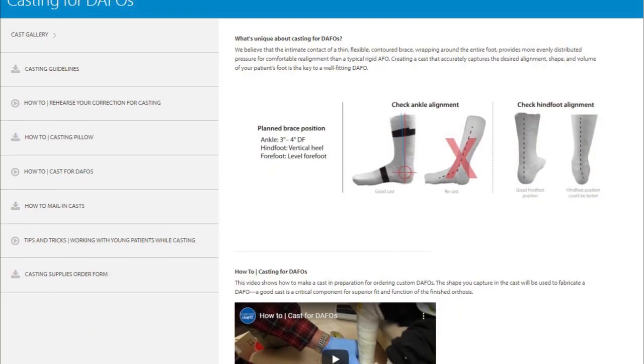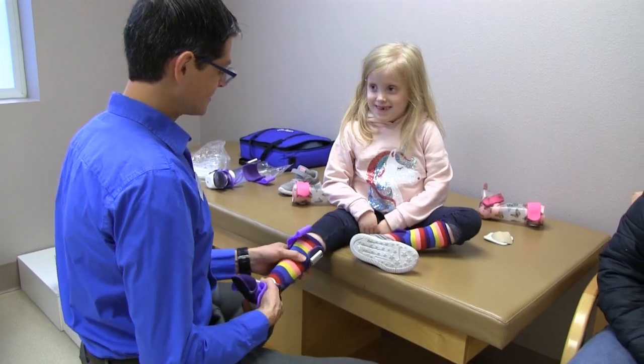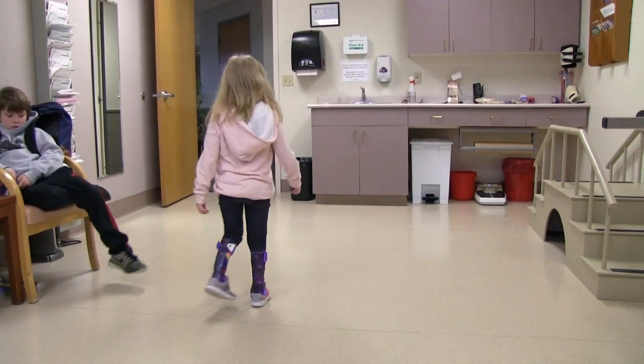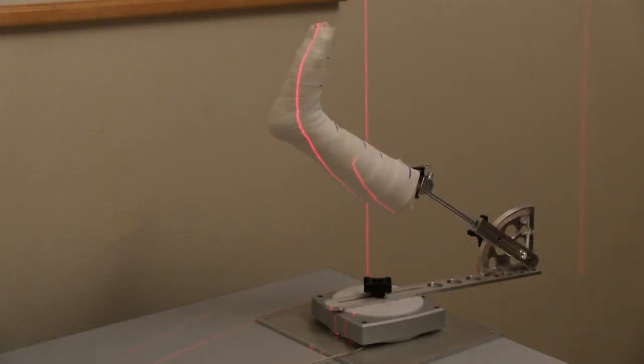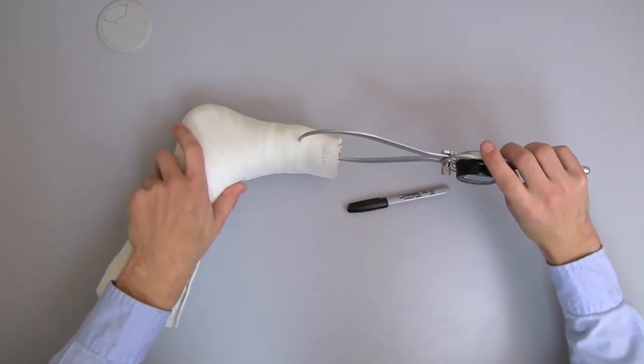You can review the basics of good casting on our website. We know that a good cast is the key element to brace fit and function. Scanning casts doesn't change that. However, here are a few extra things that you need to know about how to make a cast that will scan well and make it easy to measure the thickness.